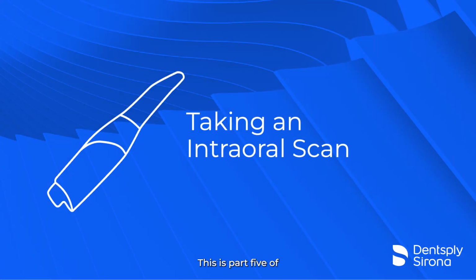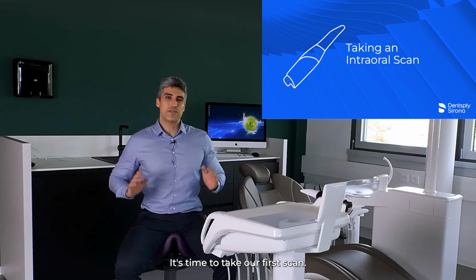This is part 5 of 8 short videos in the Getting Started with Primescan 2 series. In this video, I demonstrate how to take a status scan with Primescan 2. It's time to take our first scan.